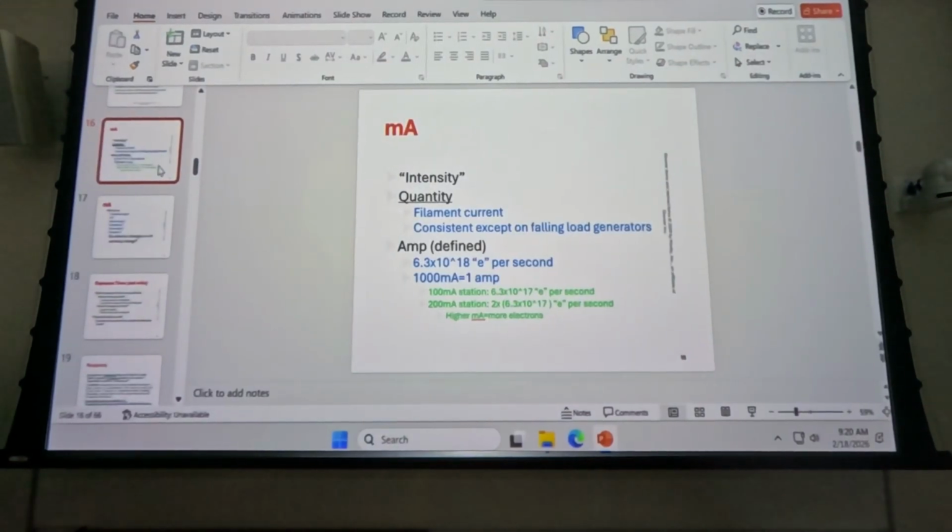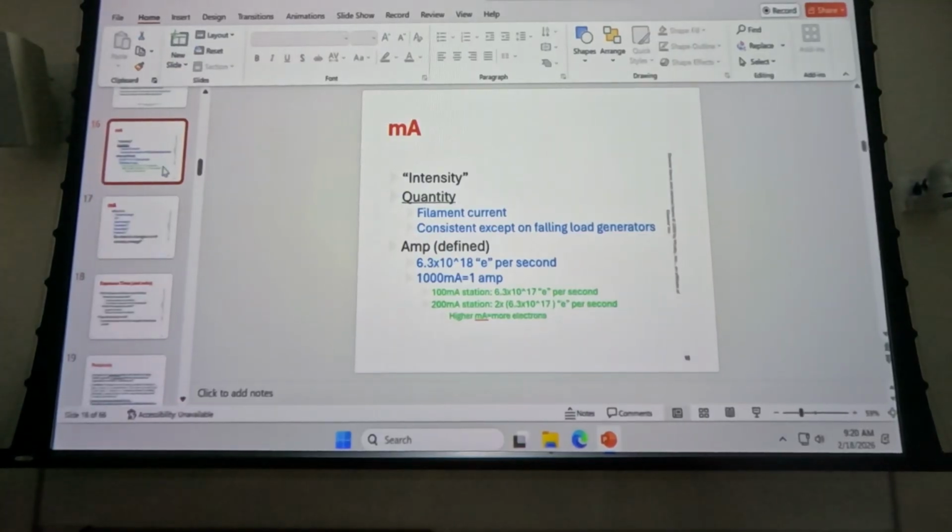Quickly review what we talked about last time, then we're going to press on and see how far we can get into this today. Last time, we talked about mA and what mA controls, both in the tube, and once we have exposure, it's one of the factors that creates mAs.